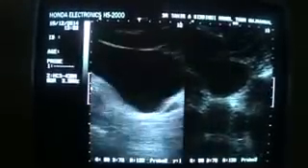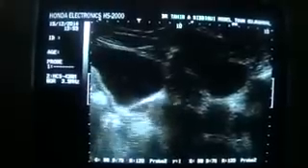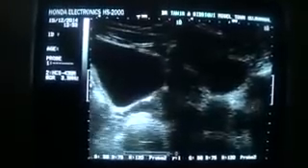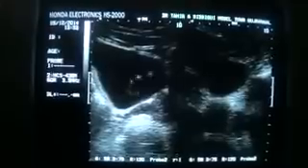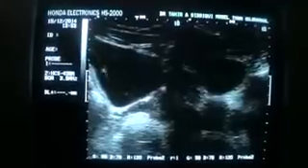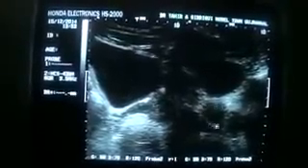Now secure it on any side of your screen, then get the longitudinal. This is the longitudinal section. This is the transverse section of the urinary bladder. This is the longitudinal section of the urinary bladder. This is the prostate. Now this is the prostate in transverse section. This is the prostate in longitudinal section.